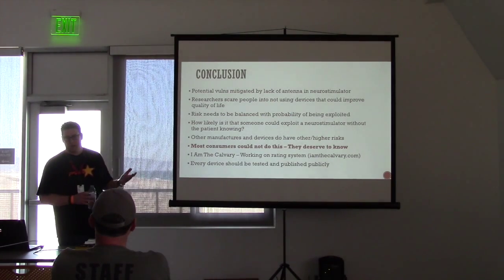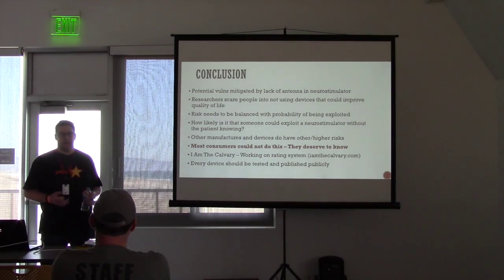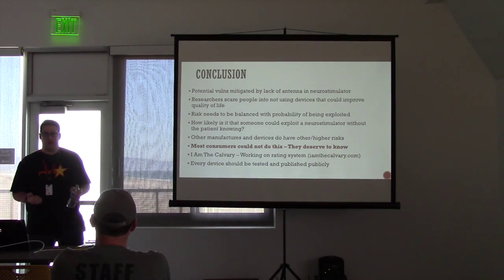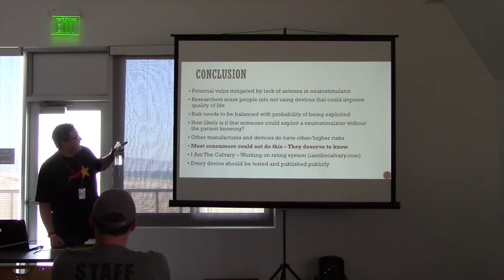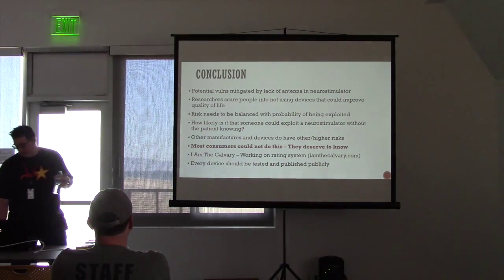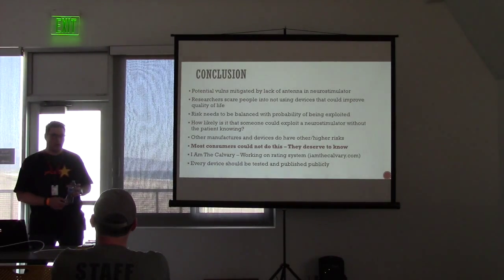There is no manual option in my wife's case. She can't do some sort of injection to do it. It's internal, it's hardwired, there isn't anything else to do. And in this particular case for this device, all the vulns that came out, potential vulns, were mitigated by one of two things.